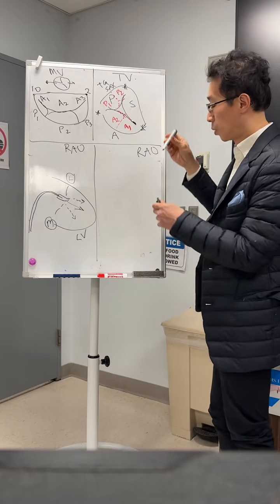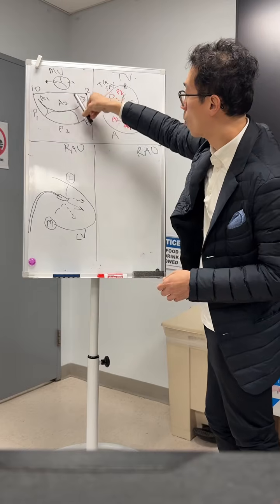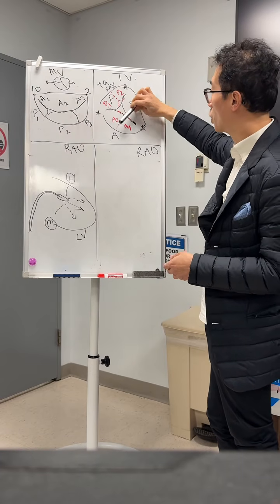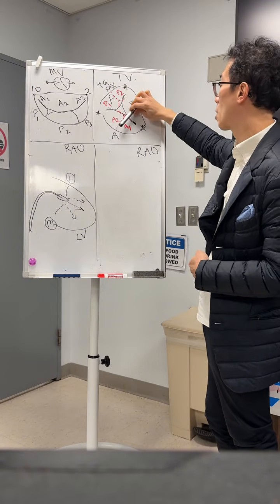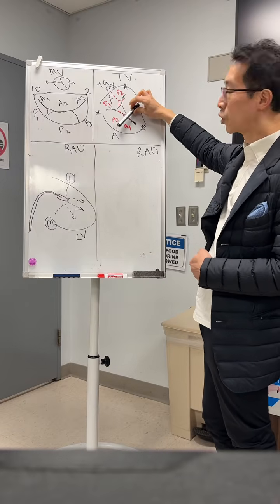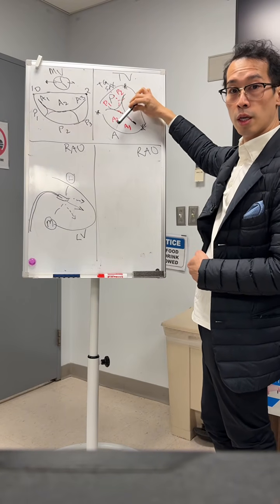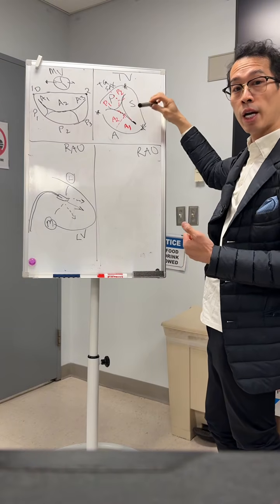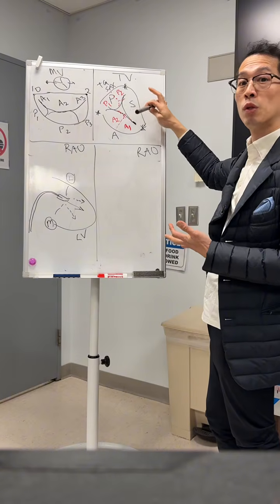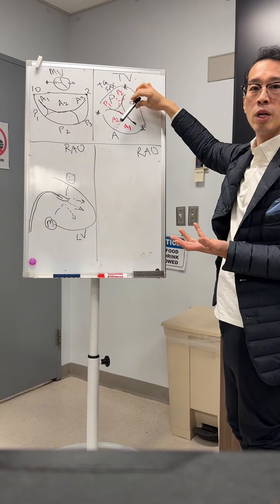So what we need to see here, just like on the mitral side, is how to respect the coaptation line. Same thing here. So for example, if you're grabbing AS, and this is the coaptation line, you should know in the imager what orientation you are. And when they show you again with the same view, you should try to reproduce that view. So for example, let's say I'm here. This is around 130, 730.